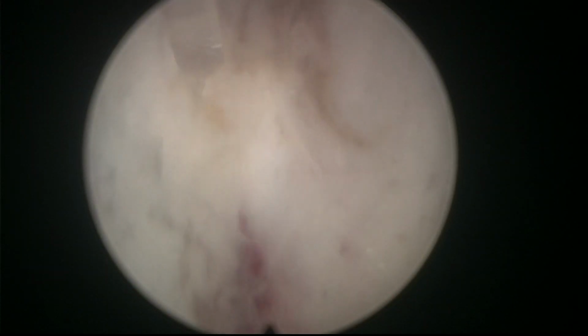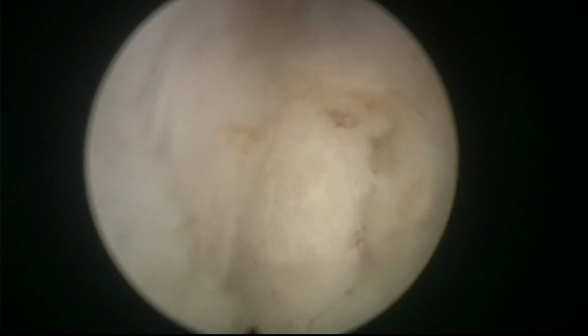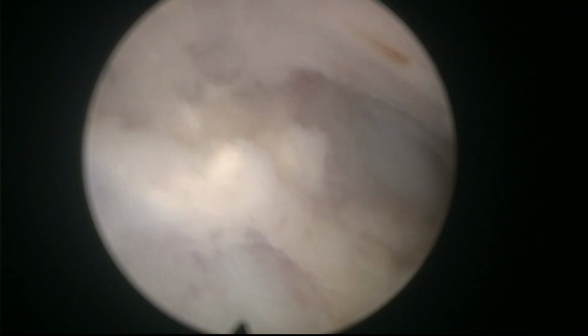Also, as we progress, the adenoma gets more mobile. It hangs from a smaller pedicle, a smaller connection area, and it's easier to tilt it from one side to the other, to push it and take it out of the way. So as we progress, we are managing to, you see, here, beautiful. Now again, never stay too long in the same place. You just go around, look how you can improve the situation. Every minute things should be better than before.